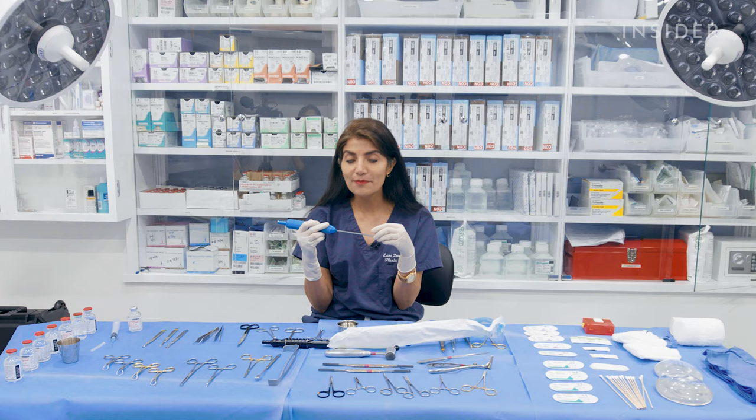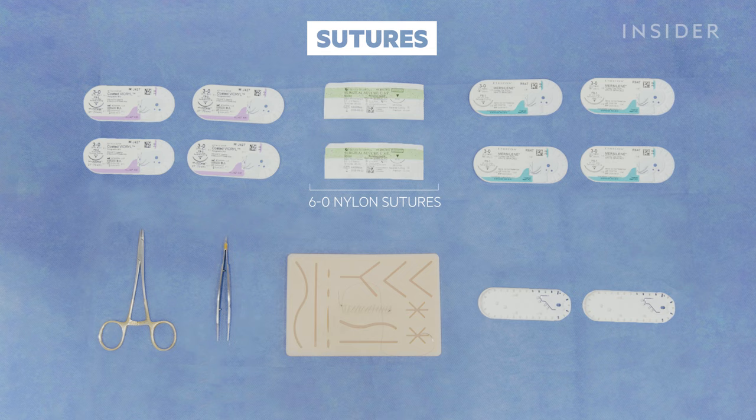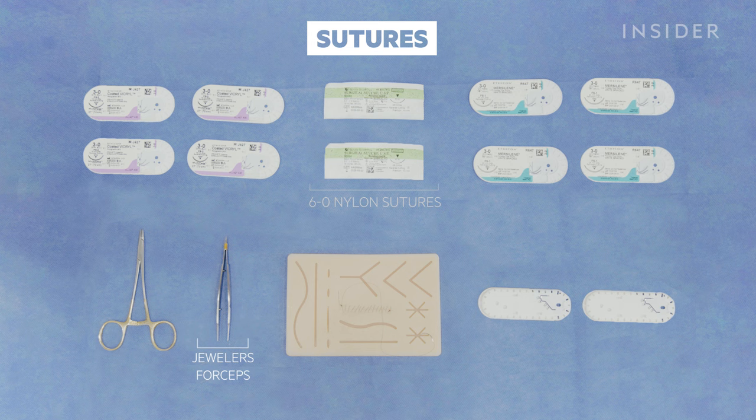Now we have to talk about one of the most important tools in a plastic surgeon's toolkit, and that is sutures. This is a little closer look at a 6-0 nylon. It's a very fine surgical suture, finer than a human hair. And you may remember these two instruments that I mentioned earlier. This is a jeweler's forceps and a fine needle driver from my blepharoplasty surgical instruments.